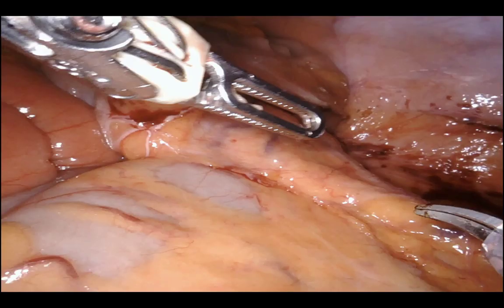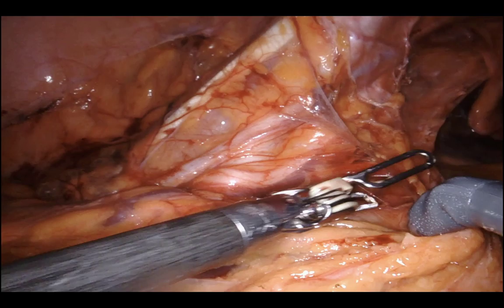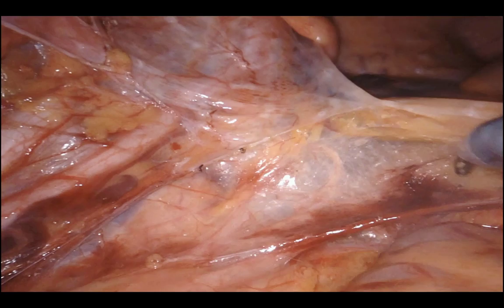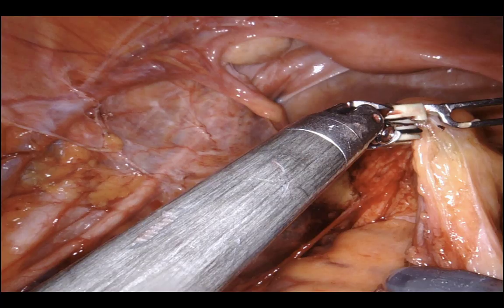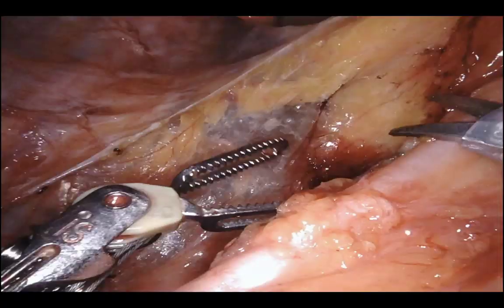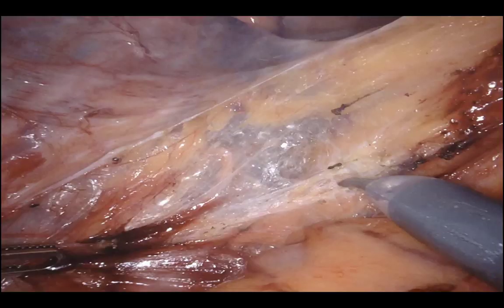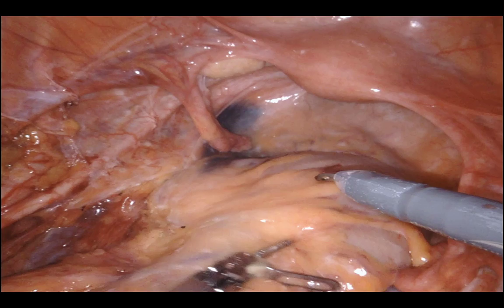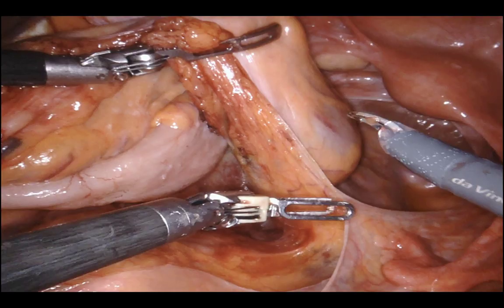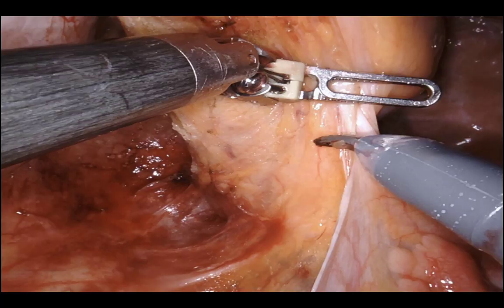Once I've gone as far proximal as needed, I go distally from the midpoint — entering the pre-sacral space and dividing lateral attachments distally to meet where I started the medial dissection. I take that down to the peritoneal reflection or wherever the medial dissection began. Maintaining symmetry at all times is a good practice in all these cases, especially in a low anterior resection where proximal division must be completed before the pre-sacral dissection.